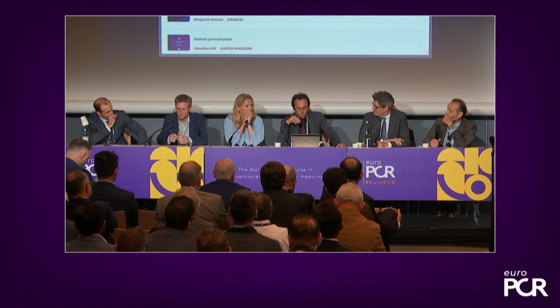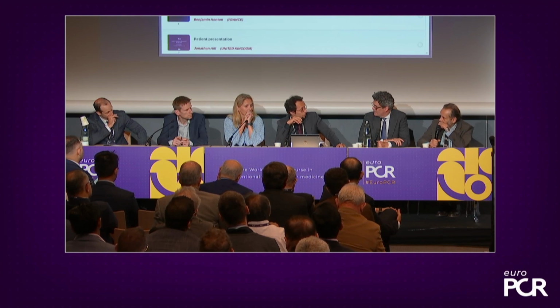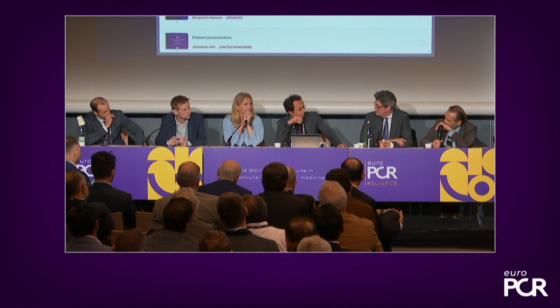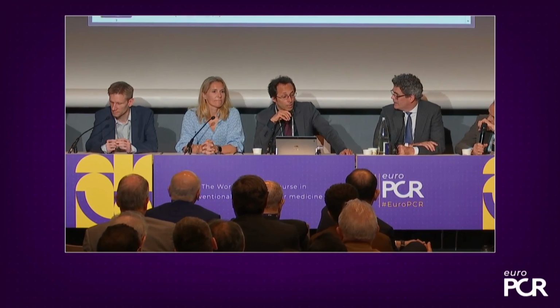Another thing I'm wondering is, when I used the first balloon ever, there was no coronary balloon. So I just went to my colleague, Professor Seller, from the peripheral lab, and we started with peripheral and coronaries off-label, right? And now we have this great M5, which you can deliver over just a normal coronary guide wire. So do you think it could be an indication even for long lesions on the RCA, for example? To use the 60 millimeter 3.5 balloon would be very great.